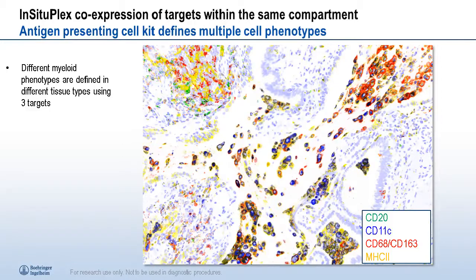And then this picture here is from a patient with idiopathic pulmonary fibrosis, and we're looking at alveolar macrophage. This was a particularly striking image to me because it really shows the biological diversity of these alveolar macrophage in the lumen of the lung. All of these cells in the middle of the tissue and on the far right are alveolar macrophage. And you can see there's this beautiful array and gradient of color from just plain yellow with MHC class II all the way to really robustly red over top of that MHC class II, to really robustly blue over top of that, or some combination in between.